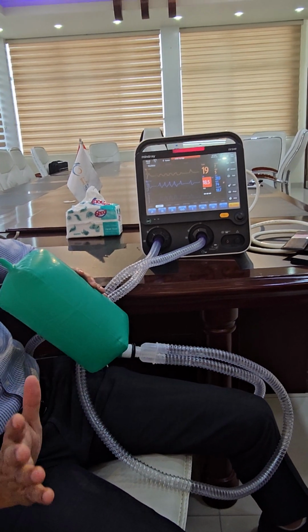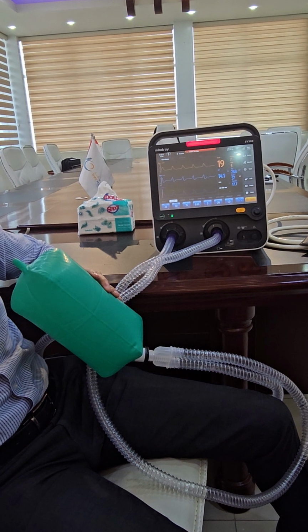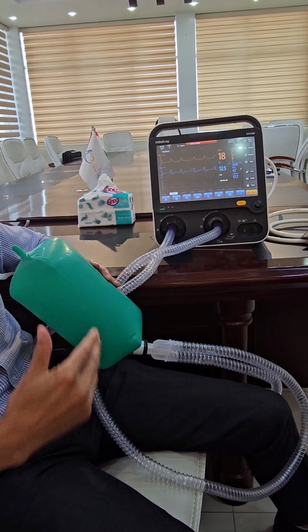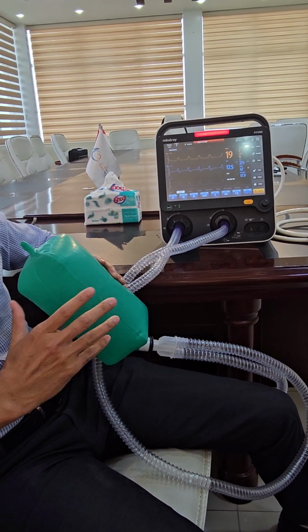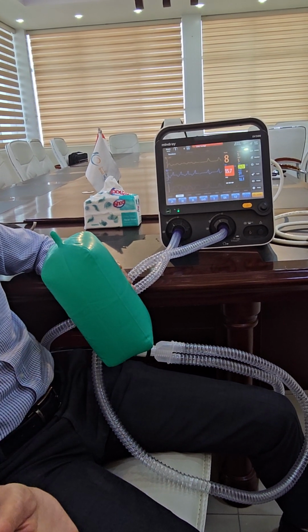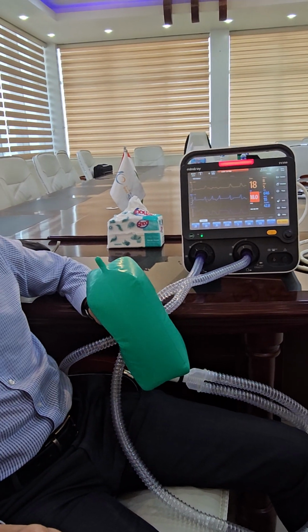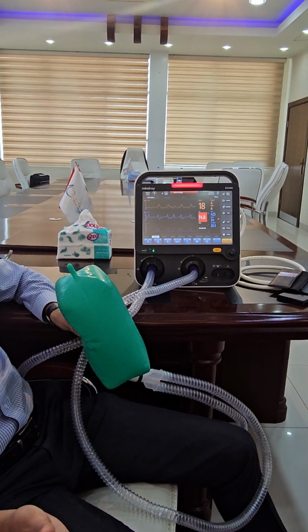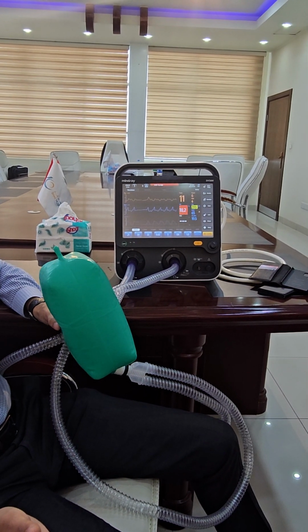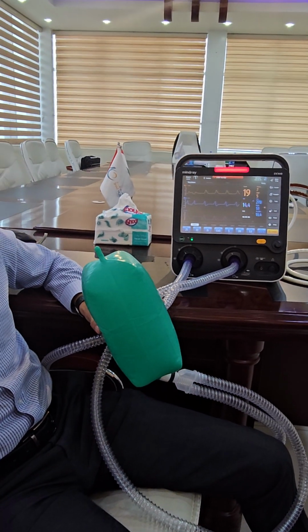Now I'm not breathing, so the machine will give 30, and it will help with whatever extra. The control gives rate 30, and anything above that, it will give. This is control. Once I breathe, it will help me whenever I breathe. Assisted means the breath is started by the patient and completed by the machine. So it gives the control and the assisted.